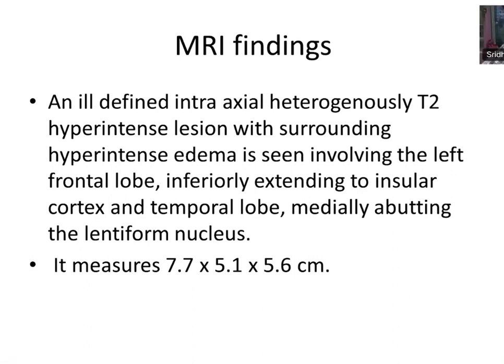So with this kind of information, surgery has been done. You got the tissue. What you have to do is you need to measure the entire tissue bits. Yeah, I think some disturbance is coming from somebody. So this is the low power view.